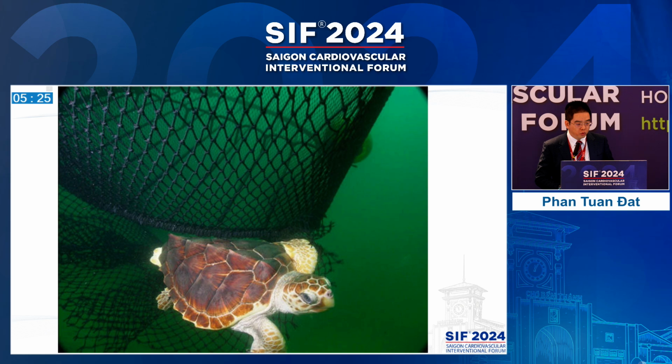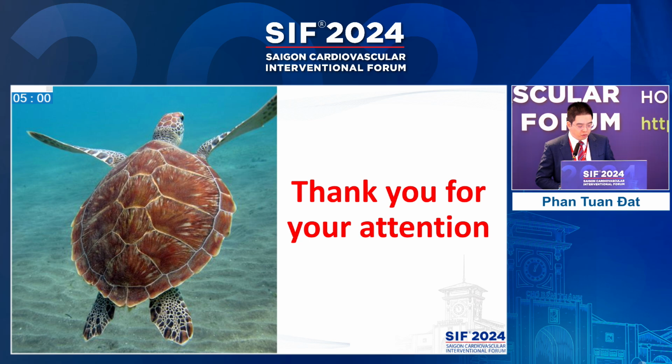So if you understand the cause, you have to pause your procedure first. You have time to understand what is the cause of the entrapment. In my case also, I won't be rushing, as I may harm my turtle. So I will use my technique to cut the net at a suitable position, so I can finally rescue my turtle. Thank you for your attention.